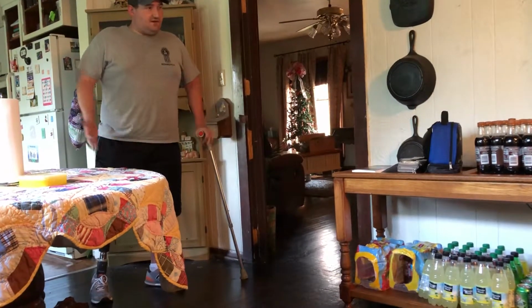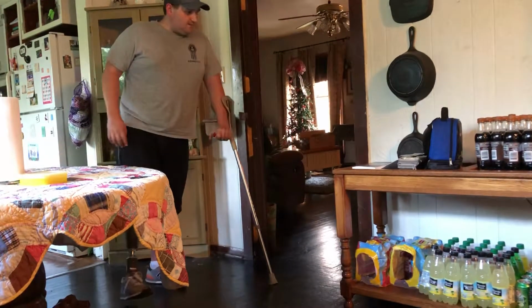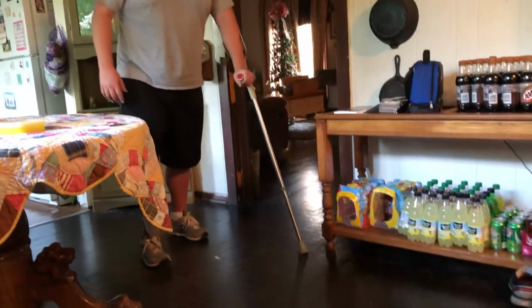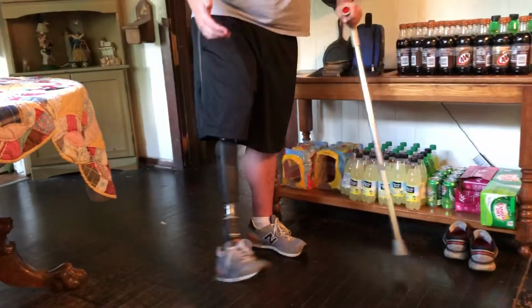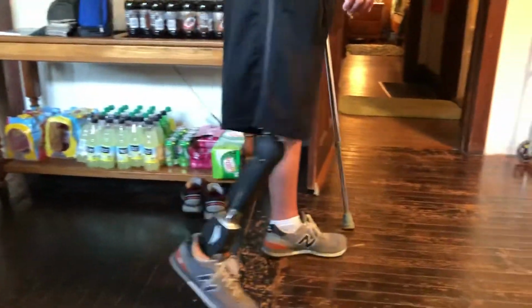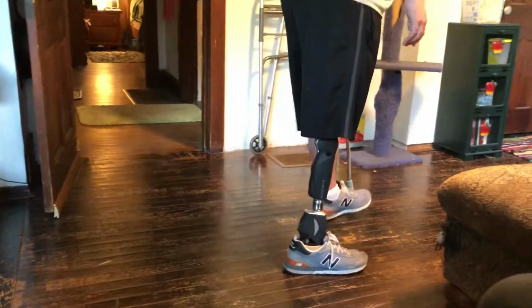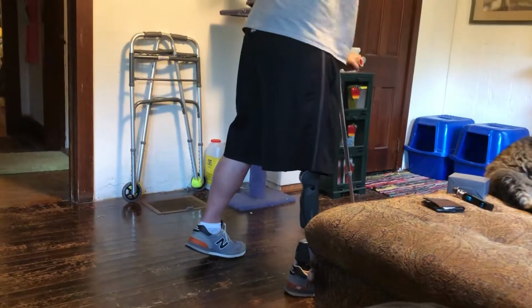So really, you need to be using your crutches and be very careful for the first week or two. But honestly, I just really wanted to see what the difference was as far as smoothness. I know now with 2 crutches especially, I can walk like 3 times faster than I could just yesterday. And I guess I can show that.